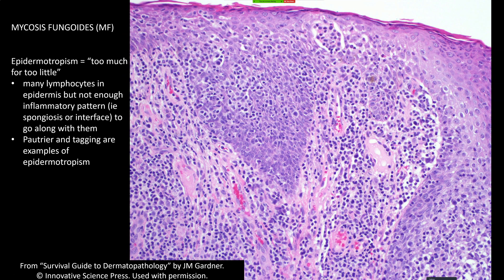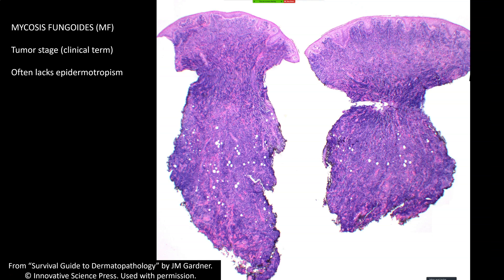Here's another case with really striking epidermotropism — Pautrier micro-abscesses plus lots of lymphocytes trickling all the way up into the epidermis, with a bit more cytoplasm than you'd normally expect. That can be confusing — you might wonder if those are melanocytes or Langerhans cells — but immunostains will sort that out. Now this is a case of tumor stage mycosis fungoides, and in my experience tumor-stage MF often lacks epidermotropism, at least in the biopsy portion I have. Don't be surprised to see a sheet of lymphocytes filling the dermis with no epidermotropism at all.